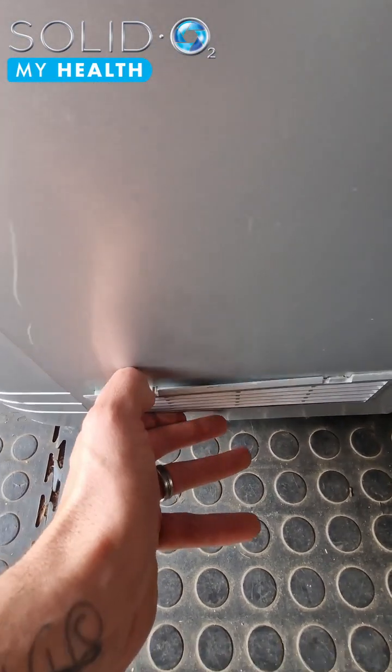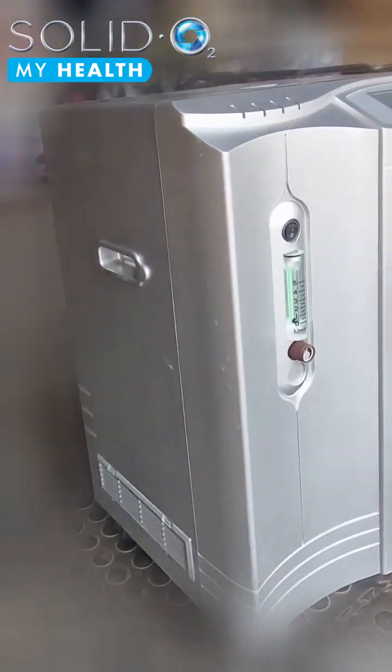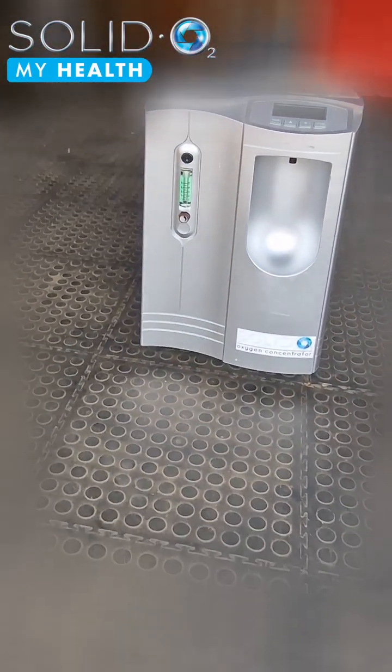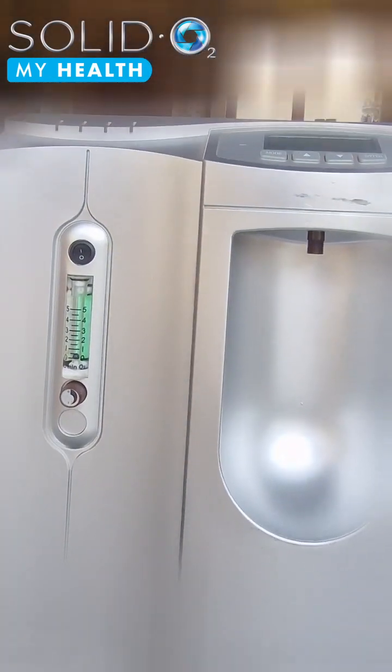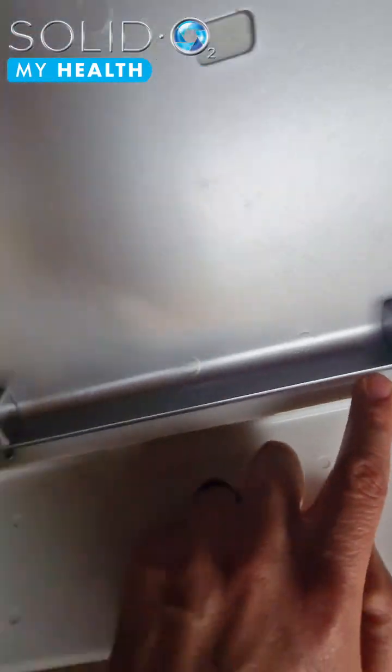So here we go. Usually your common dust filters can be removed with a simple clip on the side of your concentrator. You can wash these as spoken about earlier and replace them back in after they are dry. For this model, I'm using a very common concentrator build that many suppliers use to put their own components on the inside.